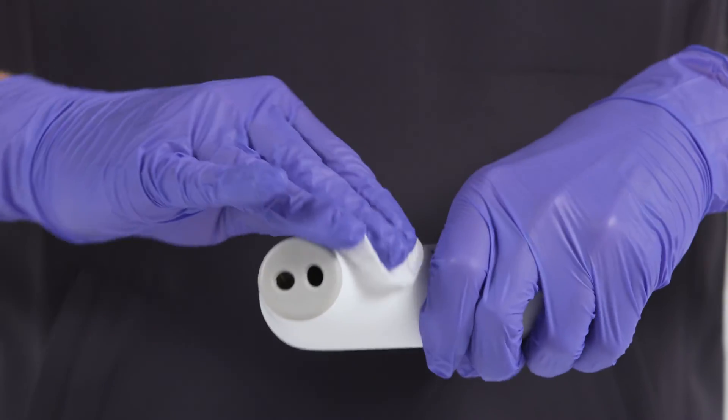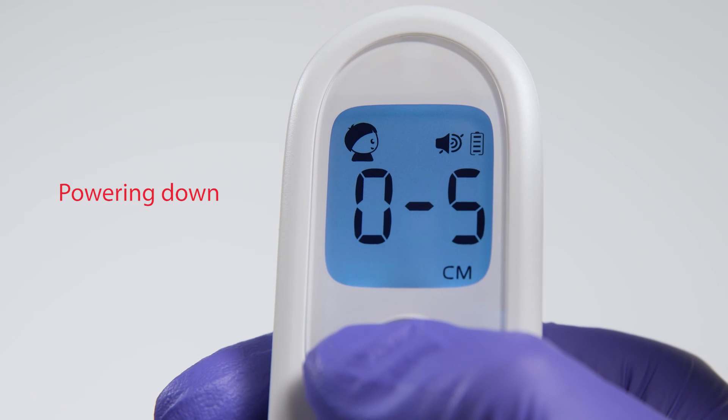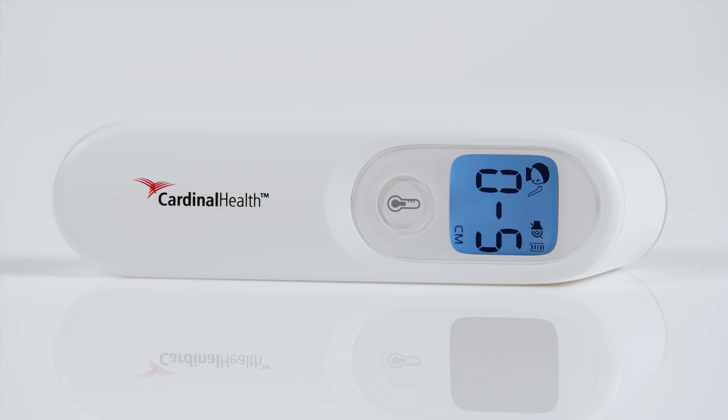Wait at least 5 minutes after disinfection before use. When finished using the NCIT, simply press and hold the Take Temperature button for 3 to 5 seconds, or wait 30 seconds and the device will automatically power down on its own.